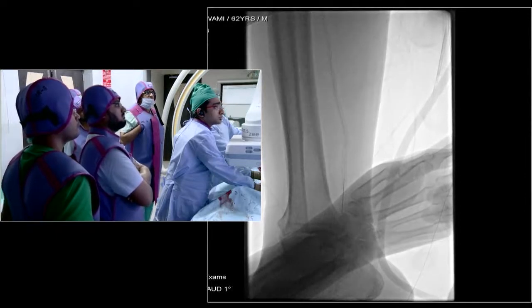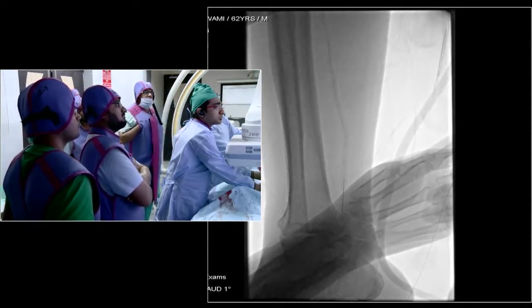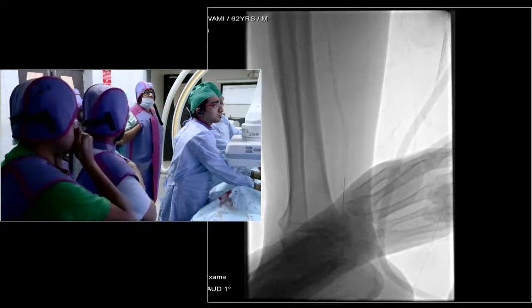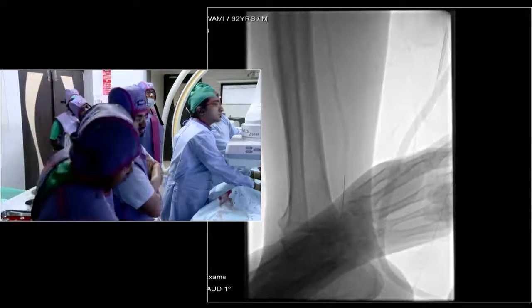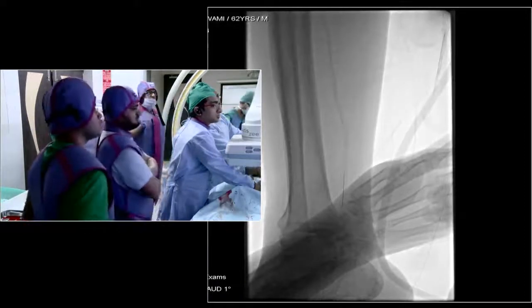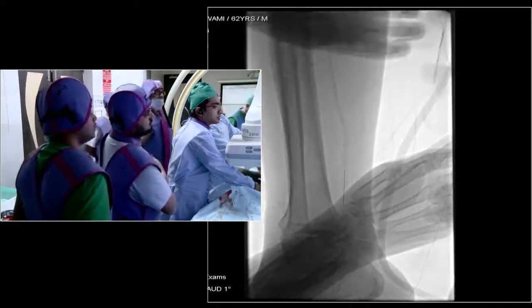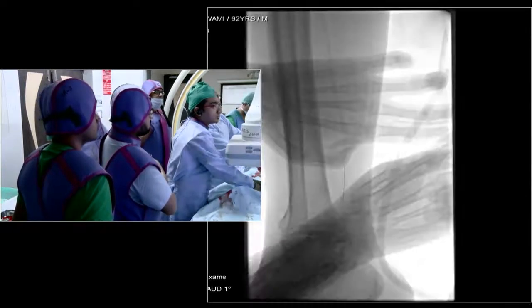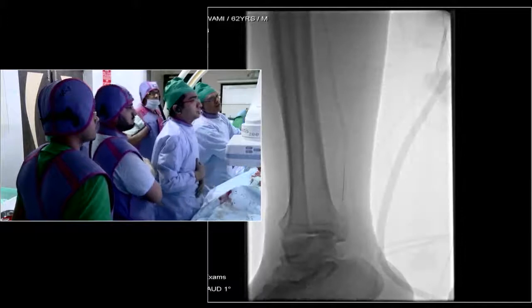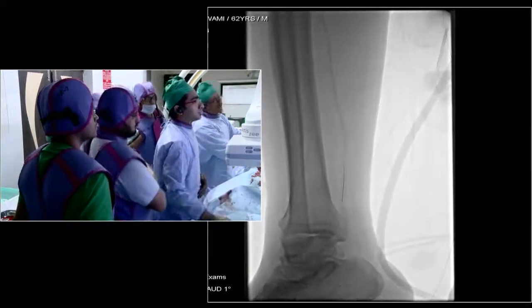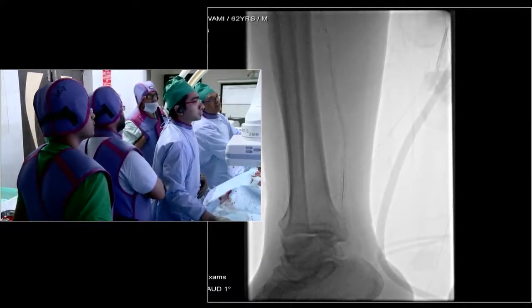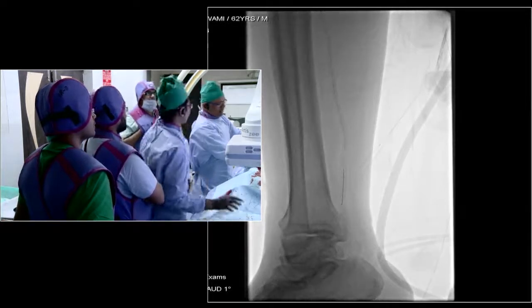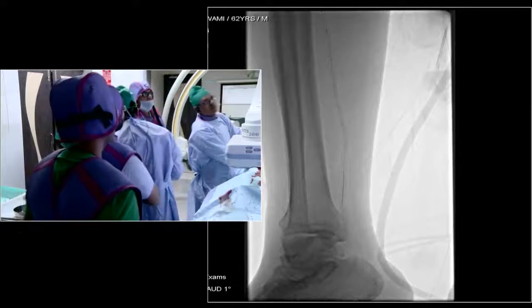We are loading the scaffold. Be careful with hands near the wire — since this is an RX system, we don't need anyone holding the wire there.